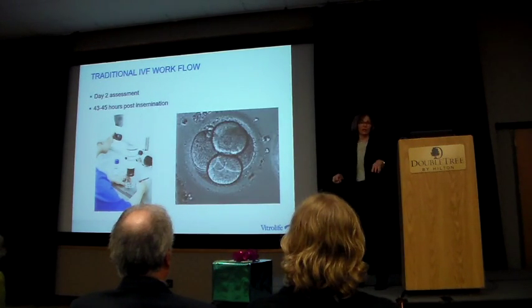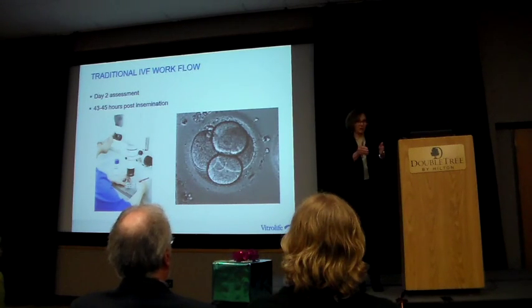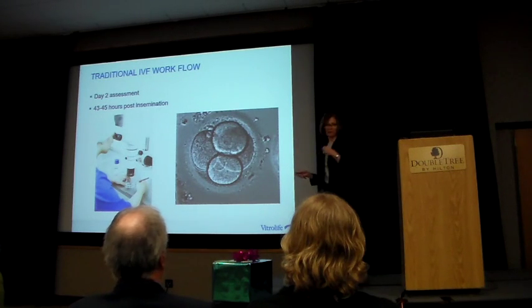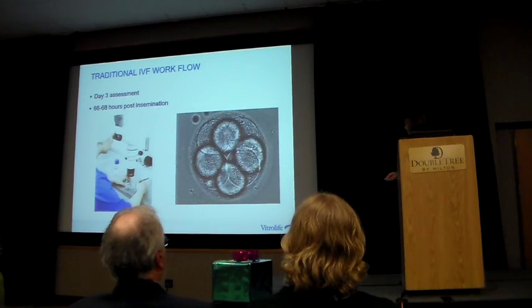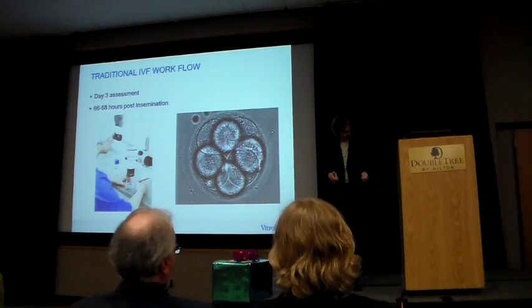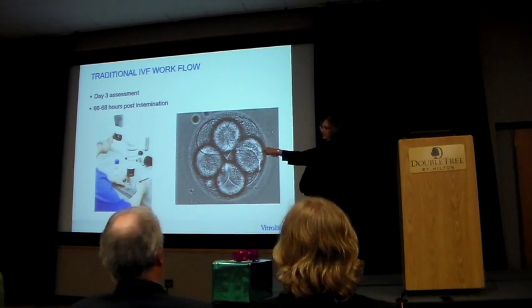The next morning, I would come into the lab, get the dish back out, walk over to the microscope, sit down, look, write notes, take the dish back. So I hope you're picking up a pattern here. Day 3, go to the incubator, get the right dish, look, write notes, take the thing back.